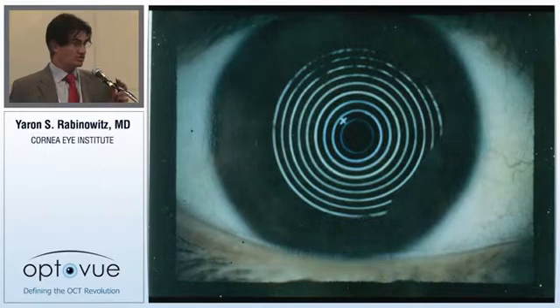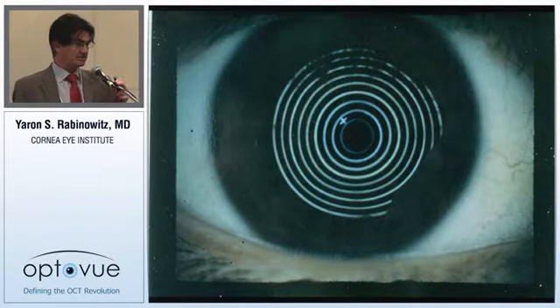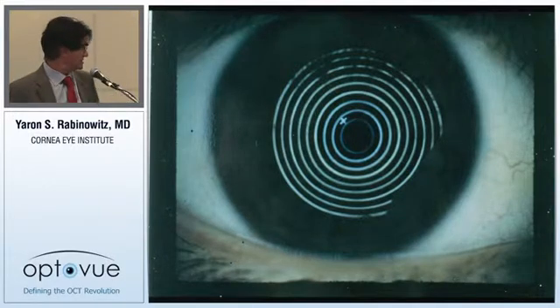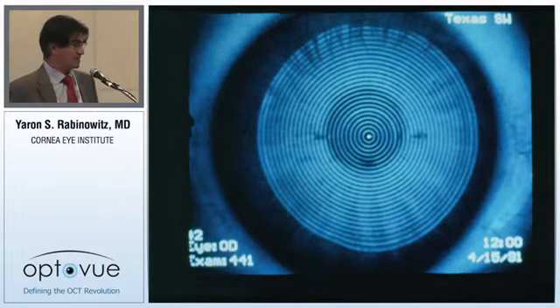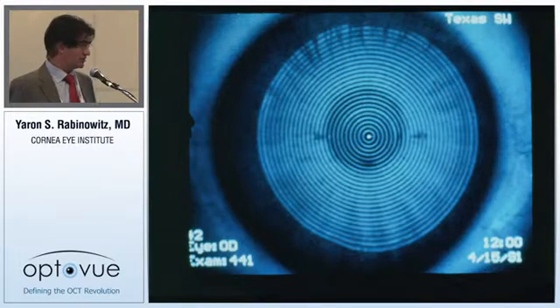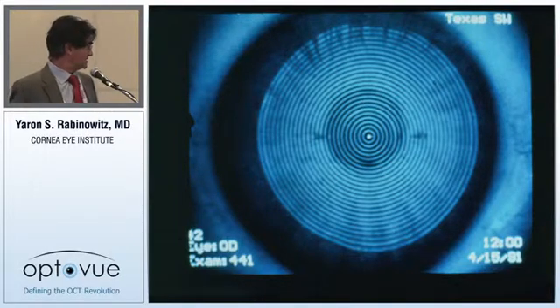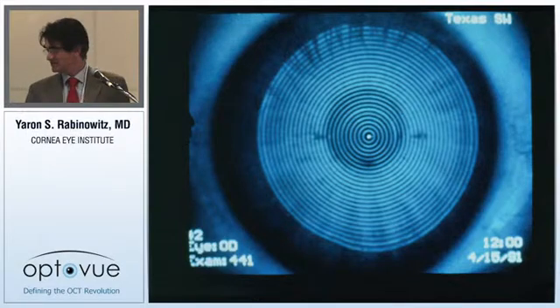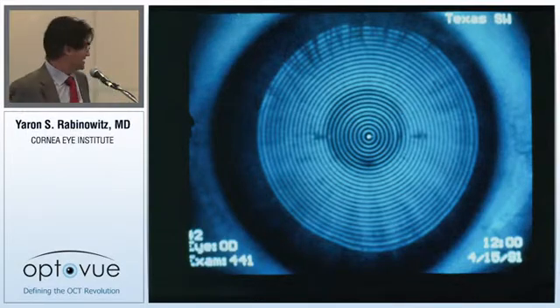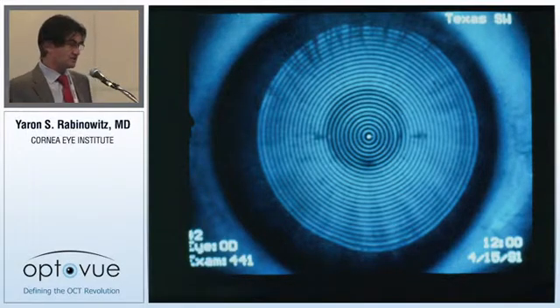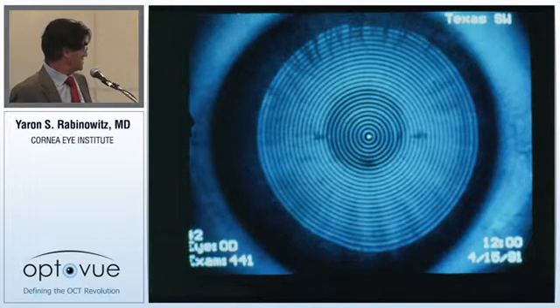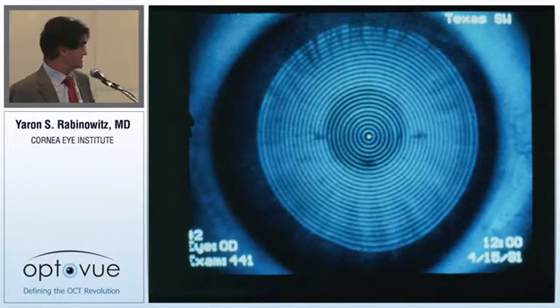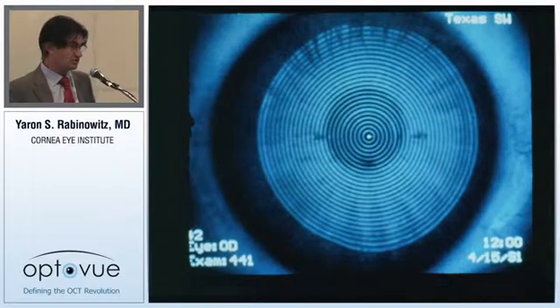This is the corneoscope, which was the next iteration after the handheld placido disc, and then came computer-assisted videoceratography, which has been around approximately 20 years. The nice thing about videoceratography is it spans the whole cornea from center to limbus, gives you thousands of data points, and is relatively accurate and reproducible.